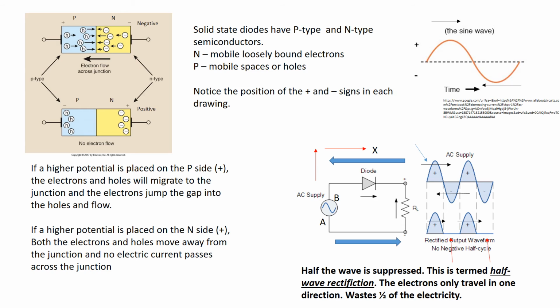They get to the diode, but what did we learn? Electrons cannot flow with the arrow. They only can flow against it. So at that point in time, the electricity actually is stopped. Take a look at the bottom drawing there. Notice the half of that cycle, the hump that would be below the horizontal line, it's gone now.